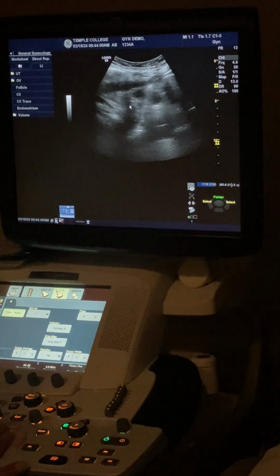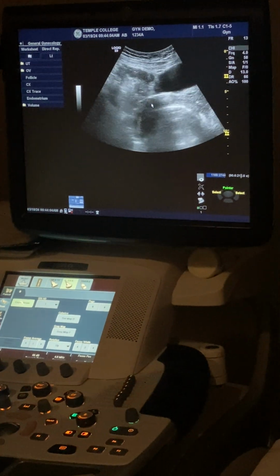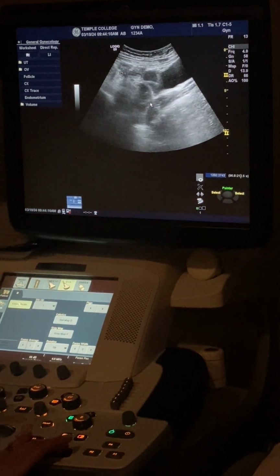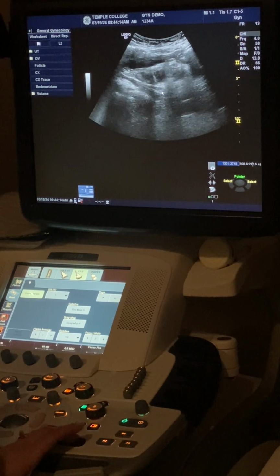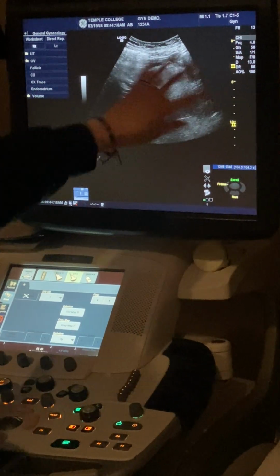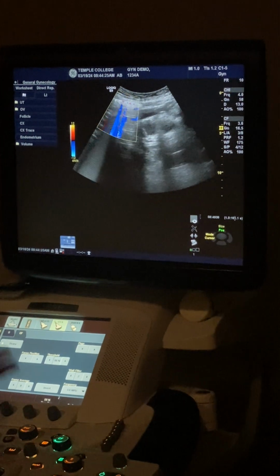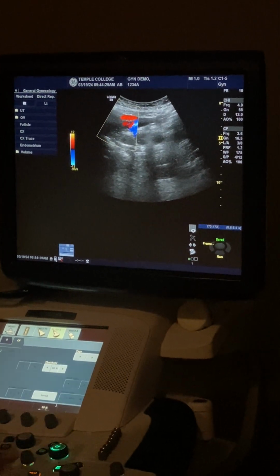So does everybody understand what I say? Don't just take a picture of just the iliacs. You need to evaluate that space. So you found your uterus, we're angling out, and there's iliacs. They should be kind of top left of your screen. You see that? So what I'm showing is adnexal space, and I know I'm in that adnexal space because I can see iliacs. Does that make sense to everybody? Okay, so that's why we have you do it with and without color.